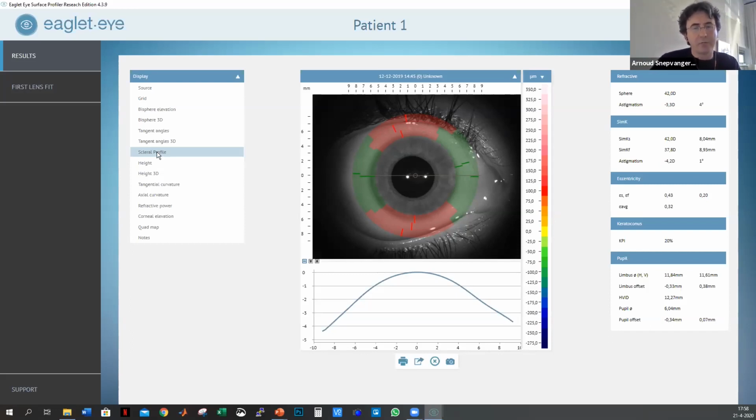It's just a pattern recognition algorithm that will compare different zones, both concentrically, from the center out to the periphery, as well as between quadrants. The colors just highlight to the user what the asymmetry of the scleral shape is. So there's no connection between these colors and the colors on the elevation map. That's correct. Right, yes.